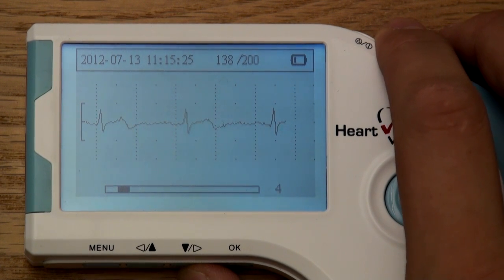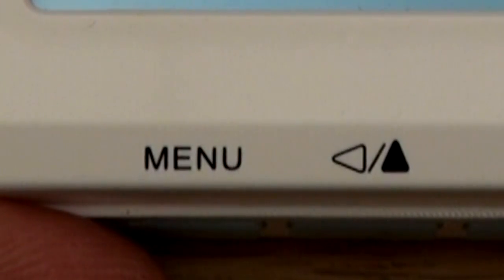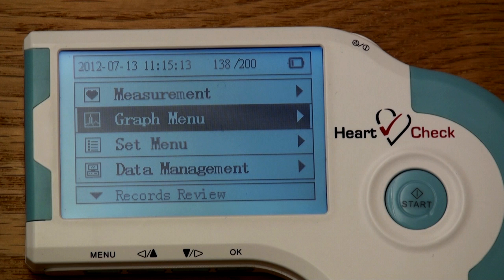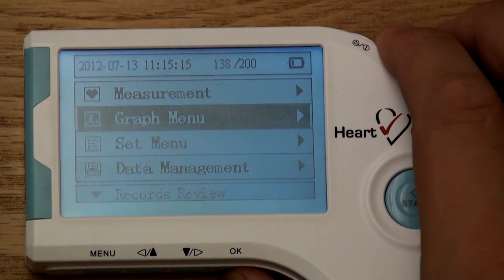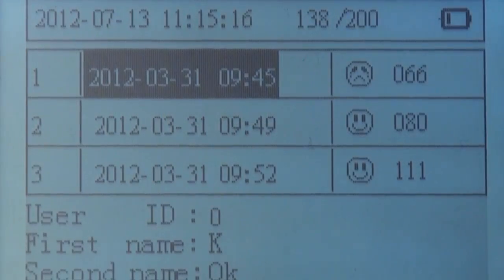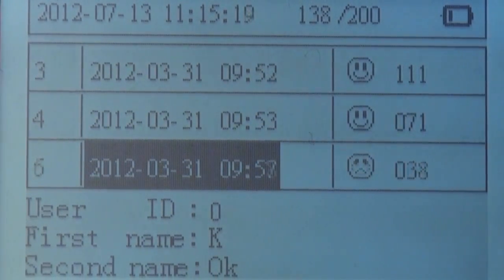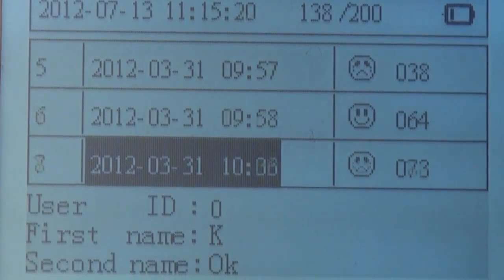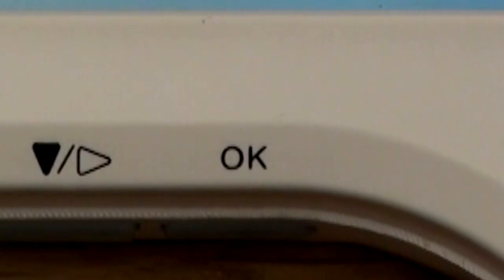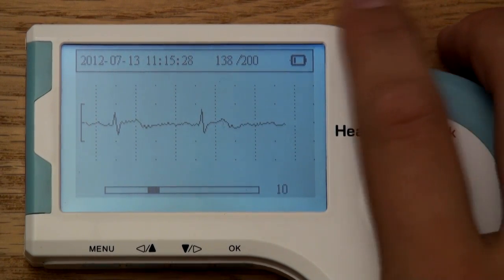Viewing ECGs on your device. In case you need to view an existing ECG recording, the HeartCheck handheld ECG device allows you to access each recording stored within your device. To access the recordings, select the menu button to browse to the home screen and use the arrow buttons to scroll to the graph menu category. In the graph menu, you can scroll through all ECGs recorded on your device. Each ECG is categorized by the date and time it was recorded, and while highlighted, the device will also indicate the corresponding heart rate, user ID, and name. To view the actual ECG, select OK on the highlighted ECG and scroll through the 30-second waveform using the arrow buttons.